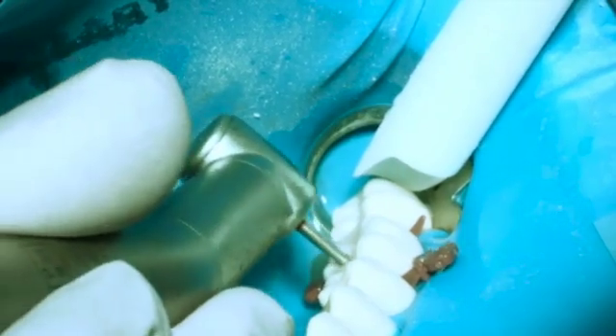So there you are. We've matched the anatomy of the adjacent teeth very quickly — dipping, dabbing, adding stuff here, adding stuff there. It's done.